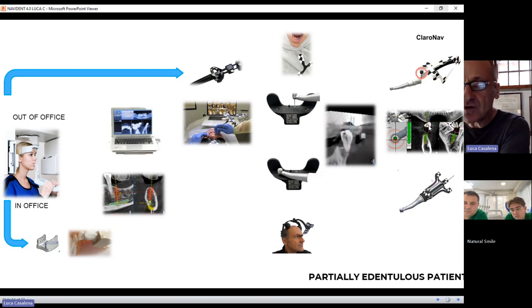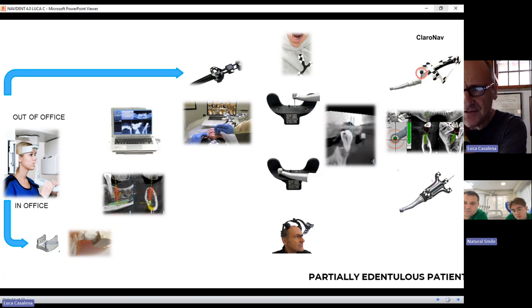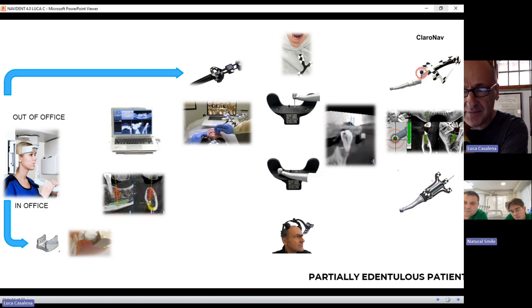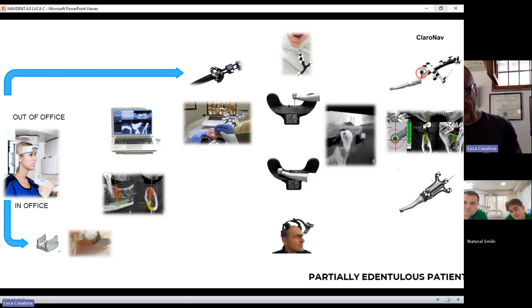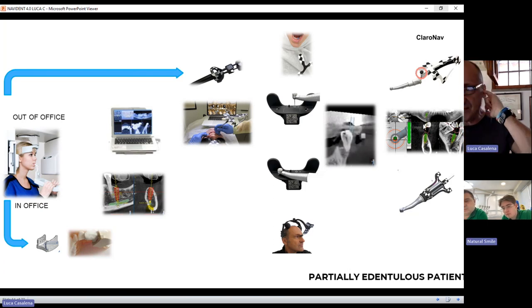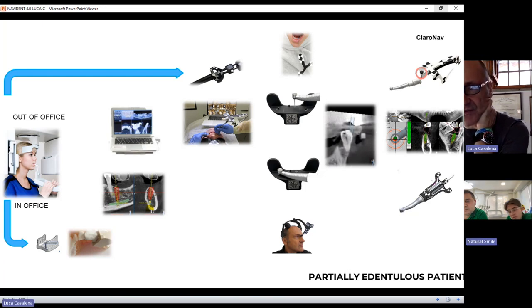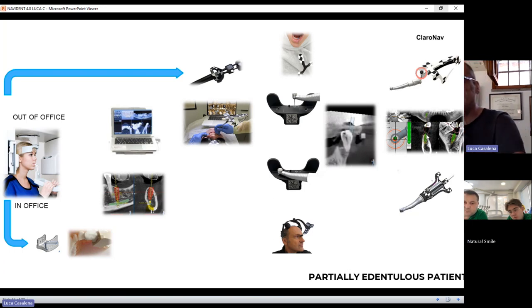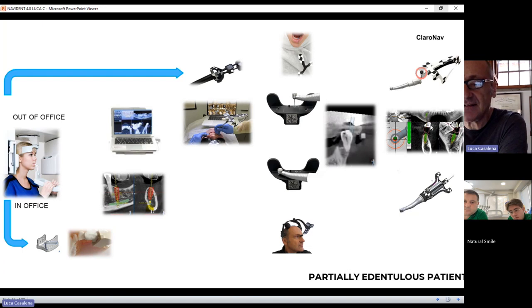There are two modes of operating. One mode: you plan an implant. The surgeon not only planned the implant but also imported an STL file — so you can see the width of the soft tissue — and imported a wax-up, so you can see the shape of the tooth. Planning took place with these two pieces of information, and the surgeon drills along the same axis that was planned. The center of the target is that axis.